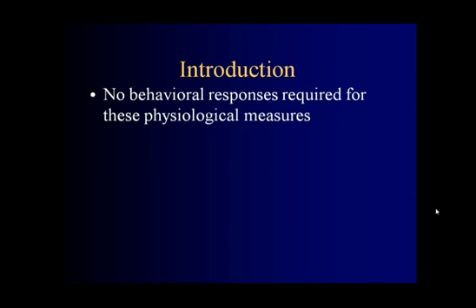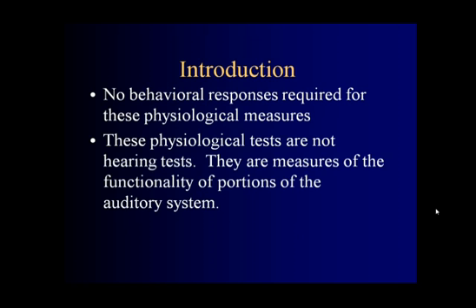In other words, we're not going to have the patient or the client respond to the presentation of sound. All they have to do is just sit there. On some of the tests, they're actually encouraged to go to sleep. These physiological tests are not hearing tests. They are measures of the functionality of portions of the auditory system.